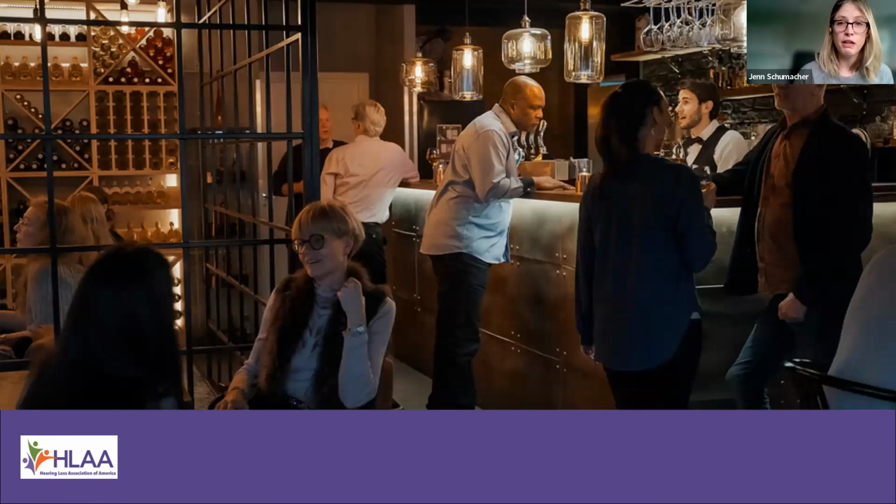As you can see, I've got a picture here. We have a gentleman up at the bar trying to order a drink from the bartender. I like to use this example because for anyone who's been in a similar situation, you can easily imagine how difficult it is to hear with or without hearing aids, but specifically without hearing aids. So we've got this nice bar that's a huge open space, very trendy, low light, nice ambiance, but it's an absolute nightmare when you have a hearing loss and you're trying to understand what someone is saying.